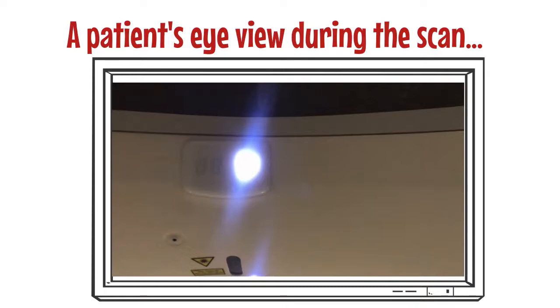These instructions are available in different languages, so do let the radiographer know before the scan if you would prefer these instructions in another language. If you think you might struggle with holding your breath during the scan, just let the radiographer know beforehand. As mentioned before, the radiographer will be able to see and hear you throughout your scan.